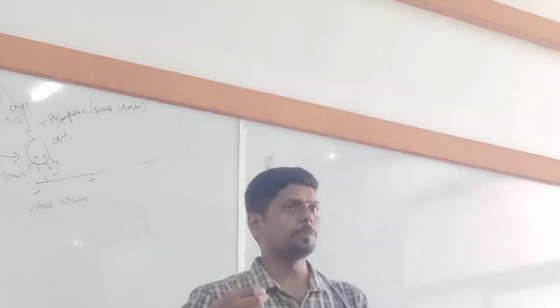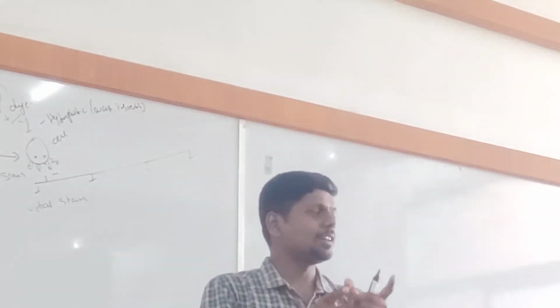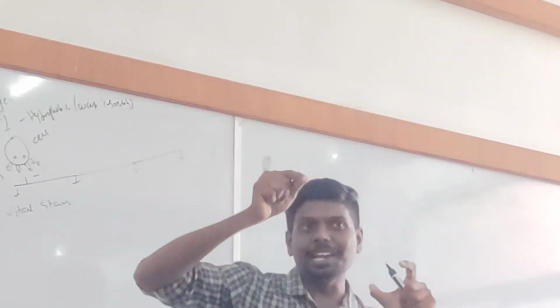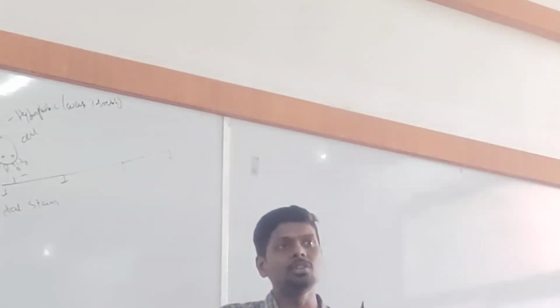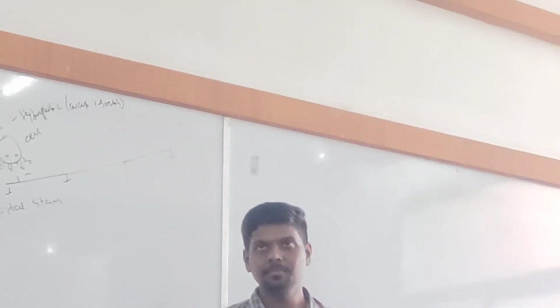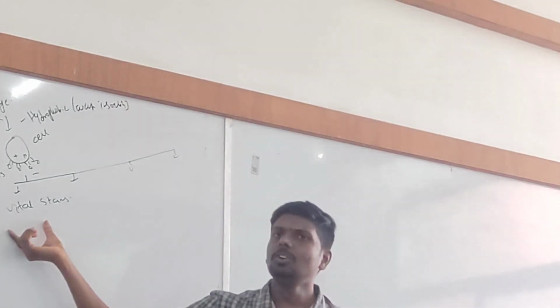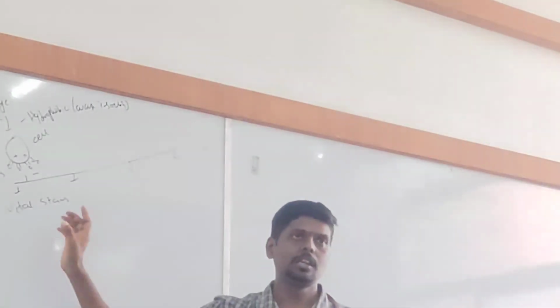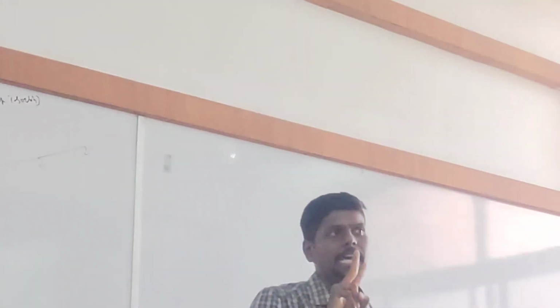I took a biopsy and I want to study only cancer cells. Both cancer and normal cells look the same, but I added a vital stain that will only bind to the living cancer cells. So there are some special scenarios where we want to use vital stains to study the living cells. Clear, right?